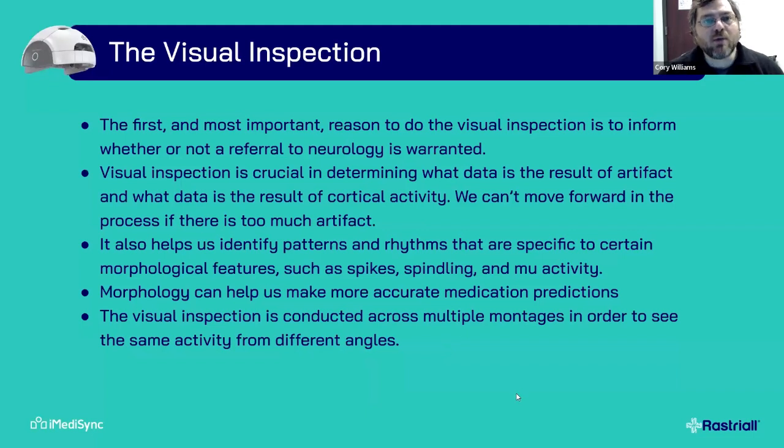So when we look at EEG, and this goes back to the origins of EEG and how it's used currently in the medical world, it's often used to detect serious issues with brain function. So things like seizures or stroke or head injury. And a lot of the time, we don't get to see that stuff unless we look at a raw signal.